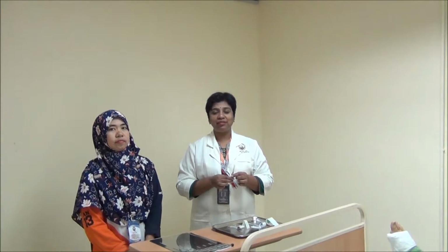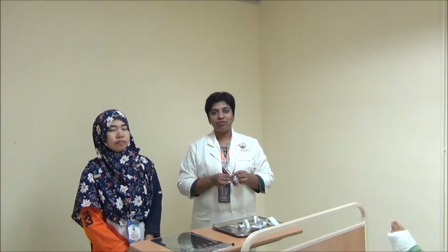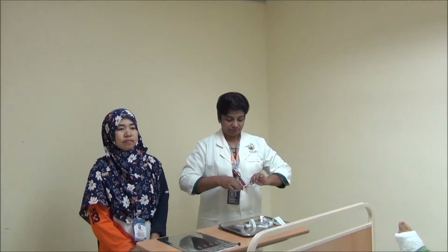Now it is ready for administration. Are you clear? Hope this clarifies your doubts. Now, Puan Izzawati will do the practical part of it. She will demonstrate how to administer injection subcutaneously in a proper manner without violating any of the principles.